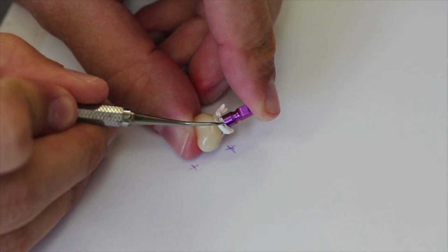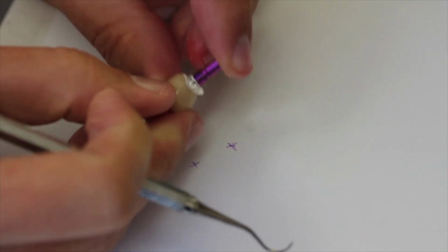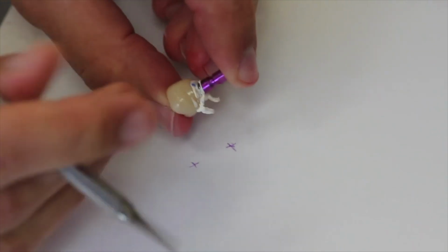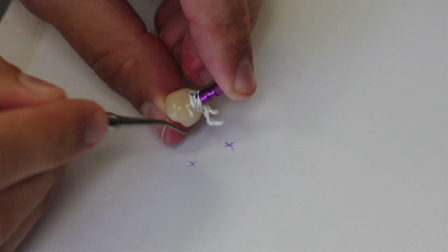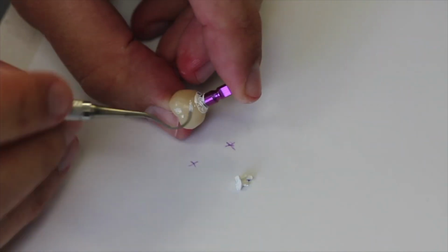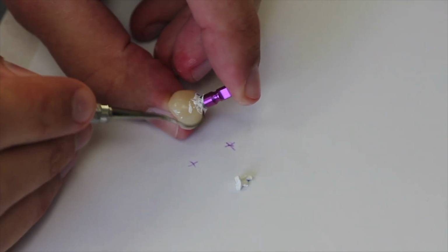After 2 to 3 minutes of autopolymerization, we'll begin to remove the excess Multilink Hybrid Abutment from the complex. After removing the gross excess, a great way to complete initial cleanup is by using a 2x2 gauze and wiping the complex clean.